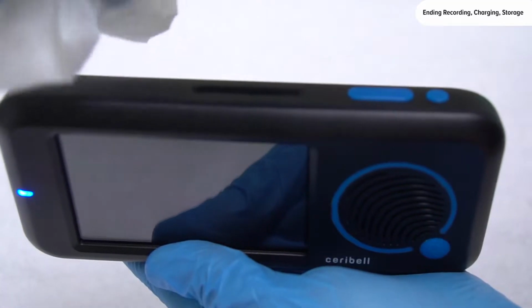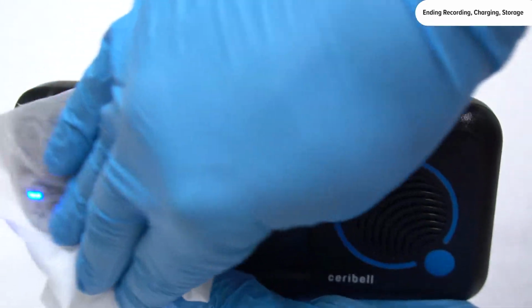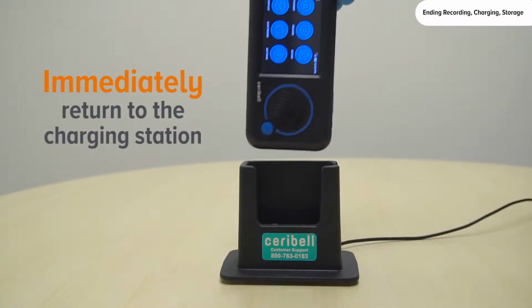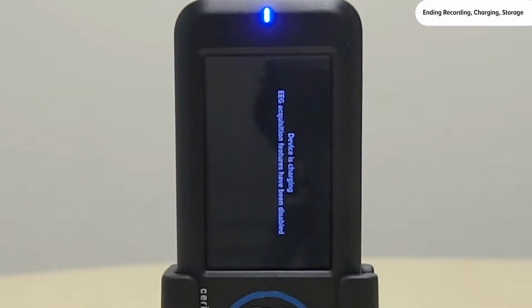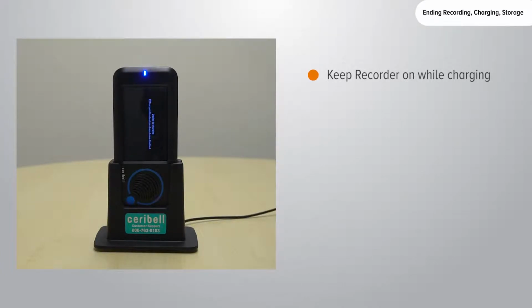After using the recorder, you may clean it with disinfecting wipes. Immediately return the recorder to its charging station. You will see a message displayed on the screen, "Device is charging." There is no need to turn off the recorder while it is charging.